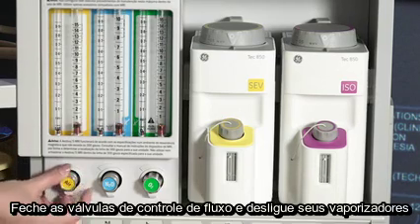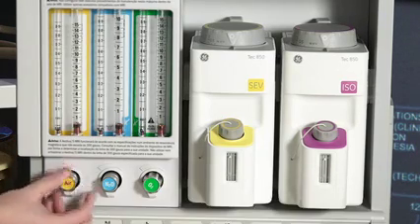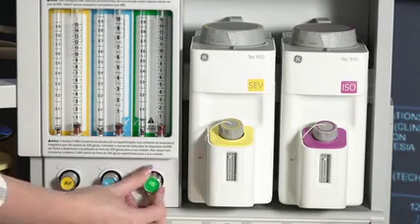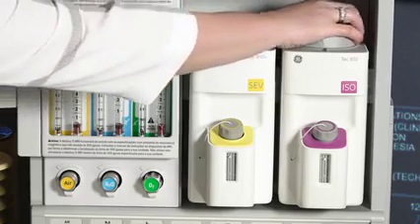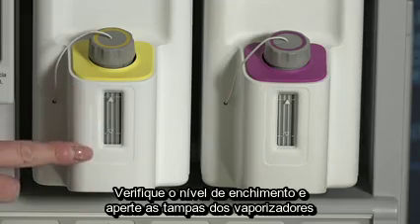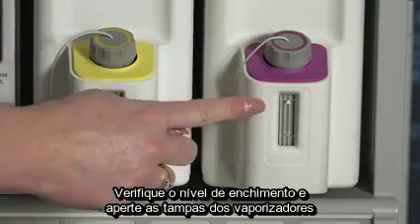Check the initial status of the low pressure system. Close flow control valves and turn your vaporizers off. Check the fill level and tighten vaporizer filler caps.